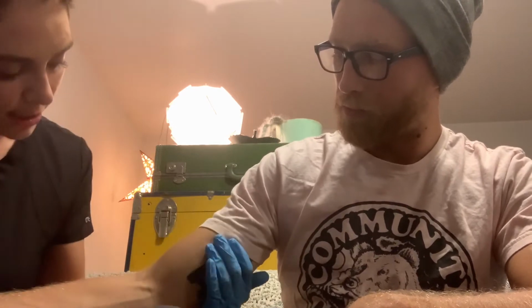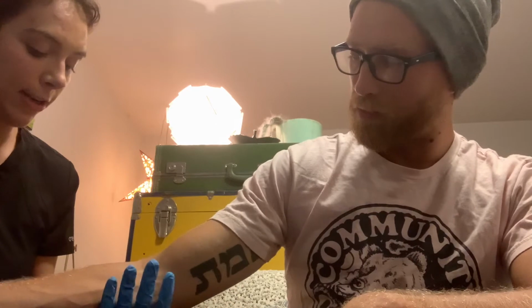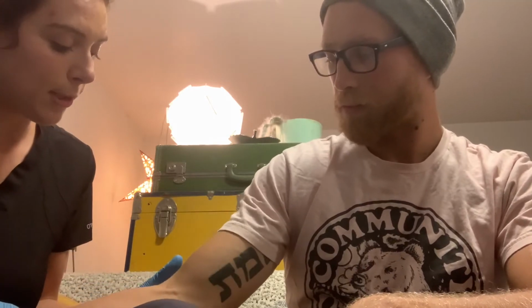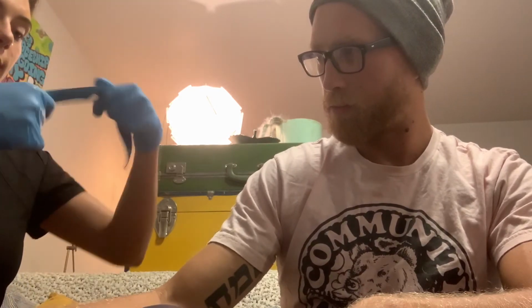And I'm looking on his arm and I can't see any areas of redness, tenderness. The patient's reported no pain. And I'm really going to be wanting to hit those large veins, so those basilic, cephalic veins. So at this point, I'm going to apply my tourniquet flat.